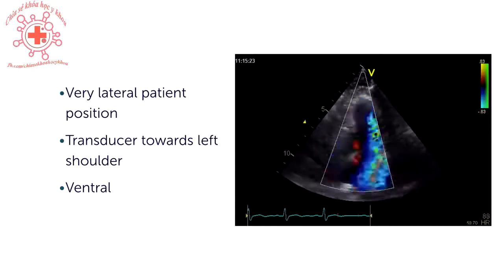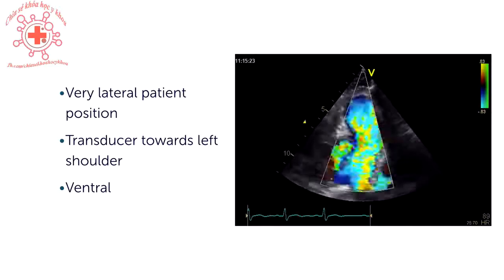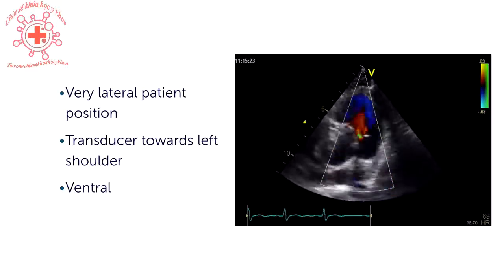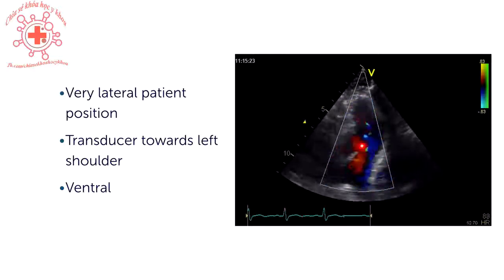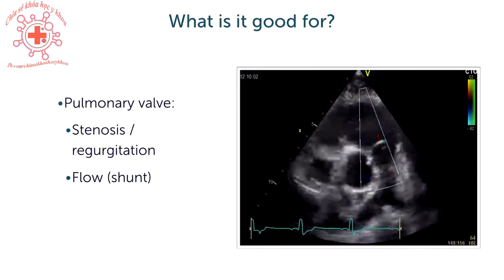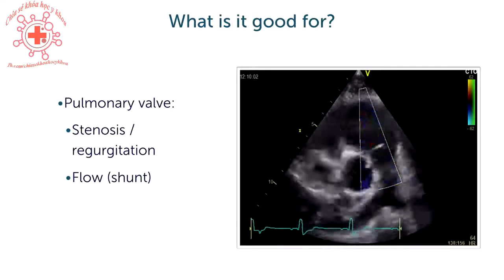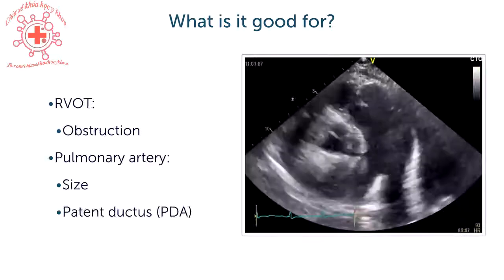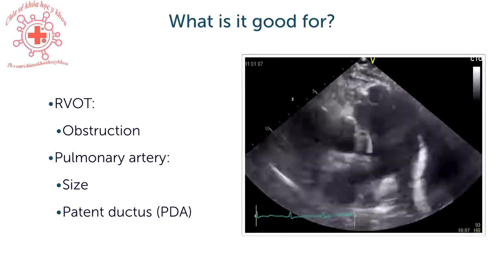Let's repeat some of the tricks. Position the patient in a very left lateral position — sometimes almost lying on his stomach. Place the transducer more ventral and more to the left by rotating clockwise, and sometimes let the patient exhale — this can also help you get good images. Here is a beautiful view where we use color Doppler to visualize pulmonic regurgitation, a very frequent finding. This view is useful to detect pulmonic stenosis and regurgitation, to look at flow, and to measure the velocity of flow across the pulmonic valve and through the outflow tract — helping to quantify shunts.